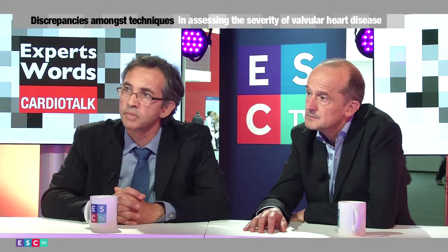Okay. Can I ask both of you now, we increasingly are starting to use CT and CMR in cardiology. Do these techniques have anything to offer in these discrepant situations? Yeah, well, first, before getting into that, John, I think we should optimize the utilization of echocardiography because this is the main modality that you're going to use. And I think the beauty of echo is that you can measure the same phenomenon in different ways. And I think you should have a comprehensive assessment and make sure that the numbers fit together. For example, if you measure low flow in a patient with aortic stenosis, but you have a normal sized ventricle with a normal LV ejection fraction and you cannot find the explanation for the low flow, there is something wrong and you have to reassess.